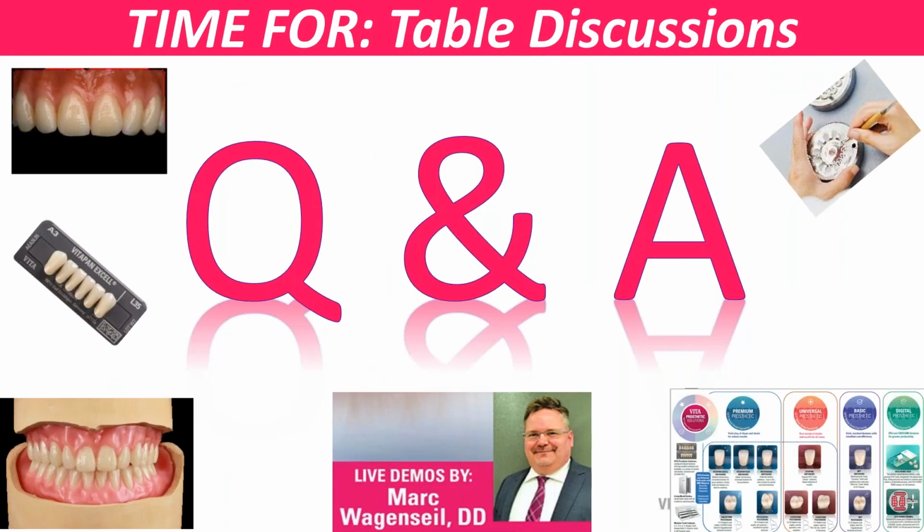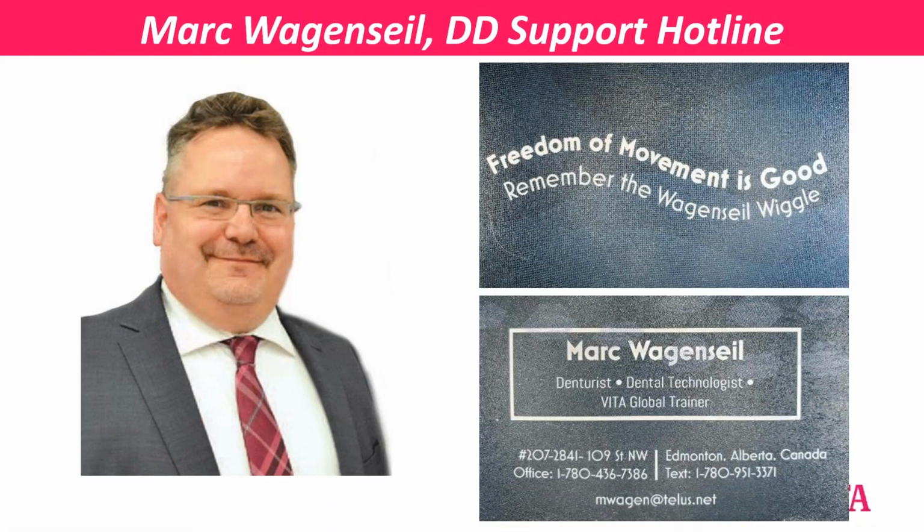And then as far as questions for today, we've got several. One of the questions, Mark, is when you do a wax try-in, do you present it to the patient with different color waxes, or do you just stick with the basic pink wax for a try-in? Do you show them that it's a possibility of characterizing your dentures, or no? Okay. That's a yes and no answer. It depends on the patient and the type of denture that we're building. So how fancy you go for that patient depends on their expectations. So I've done both. It's not an always answer. It's a depends-on-the-case answer.